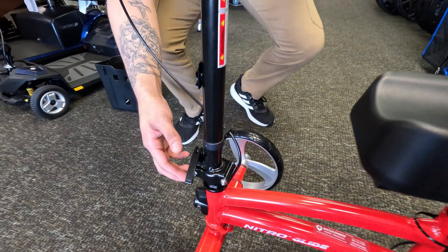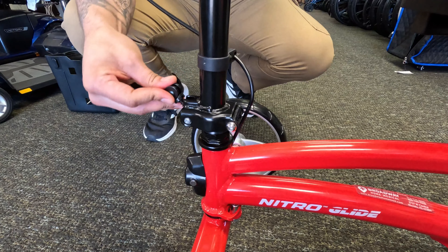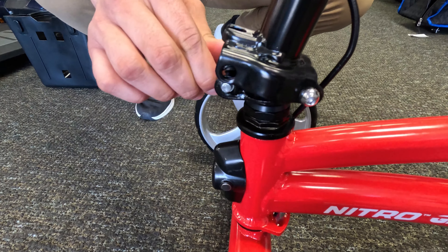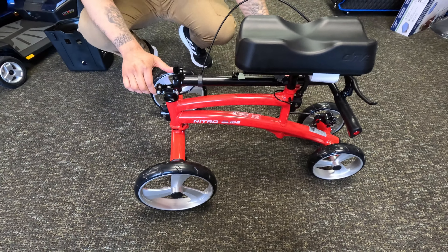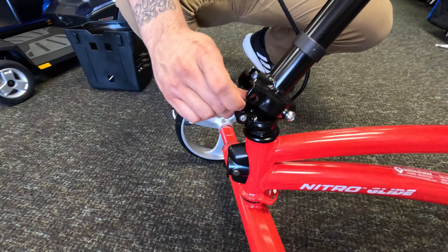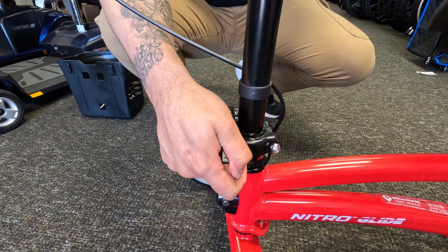Now we're going to go ahead and go to this lever, which is for storage and transportation purposes. We're going to want to release it just like this and bring it down. You can see right here that there's a little pin — you're going to want to retract that back so it can go down. It folds up, and then you go ahead and put that back into place, bring it back up, and make sure that it's locked out.